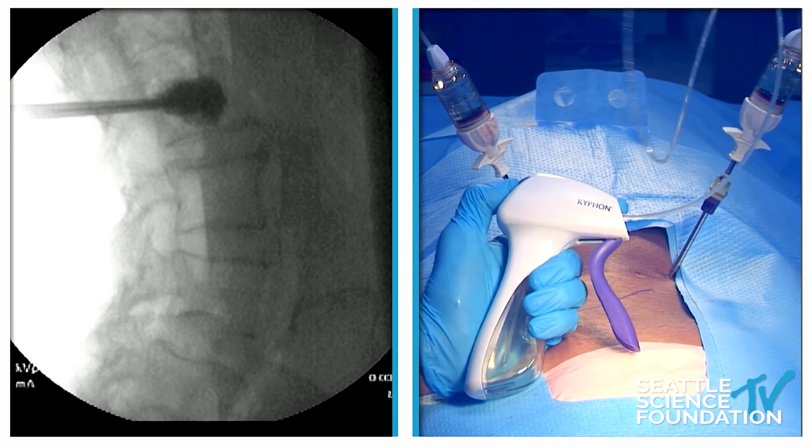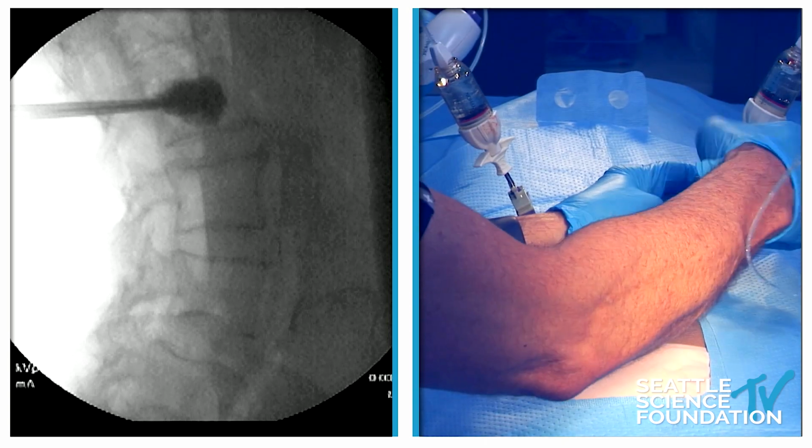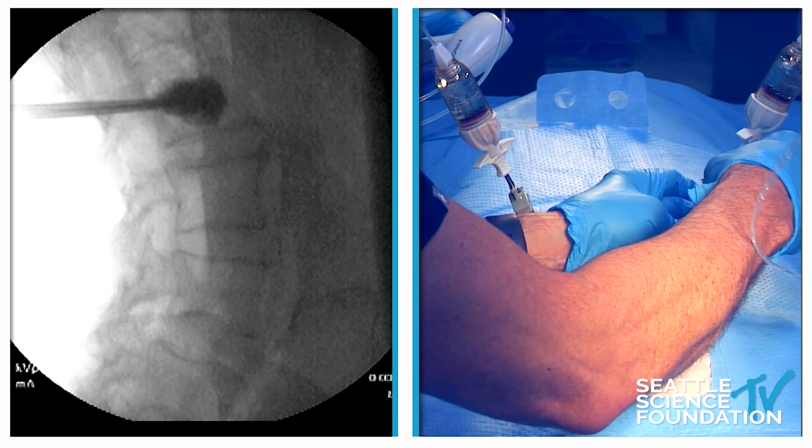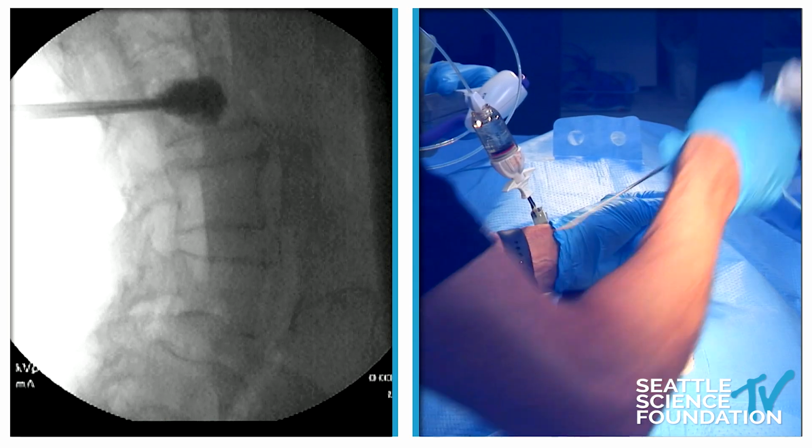So we're going to trigger that off, and this is really quite a good cement fill. I'm going to disconnect here, and we're going to put our stylets back in, and we're going to take an AP shot to see what it looks like.